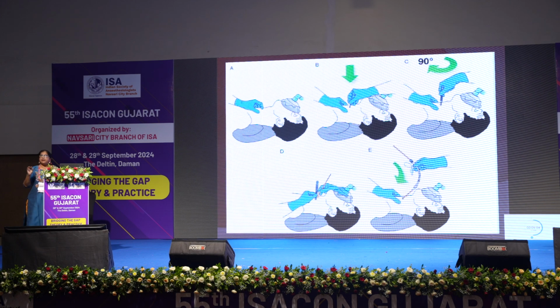This is something which is kind of simple to understand and do, but you really need a little bit of practice. So are you going to search for more cadavers? No, but you can do it simply by keeping your ventilator tubings and all, and do a practice, keep some skill over it. At least let the students practice, and even the faculty, so that you are familiar with the technique whenever the need arises, right?